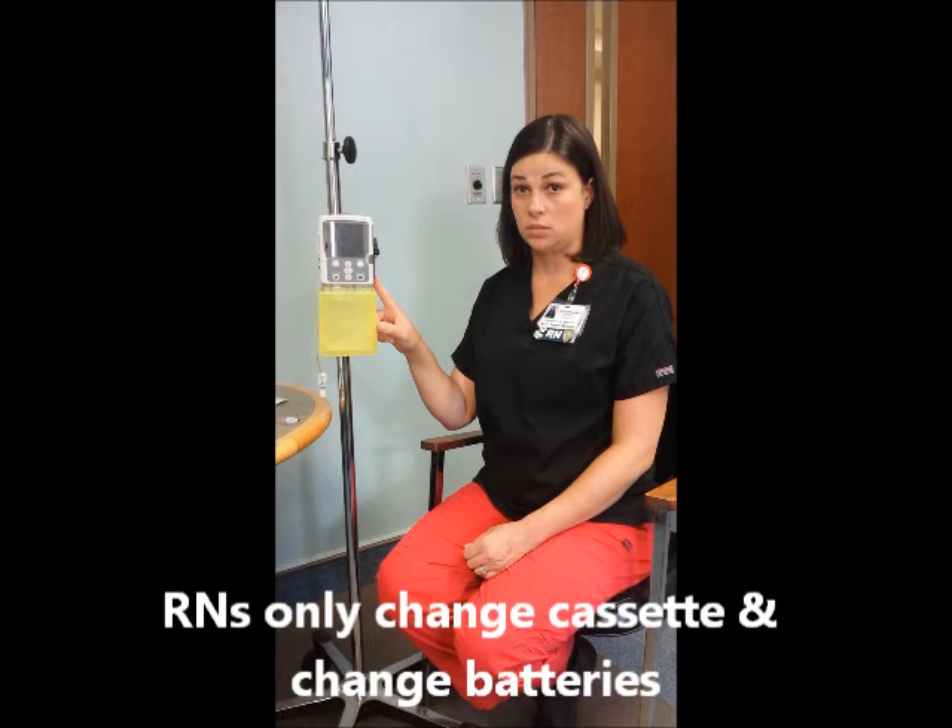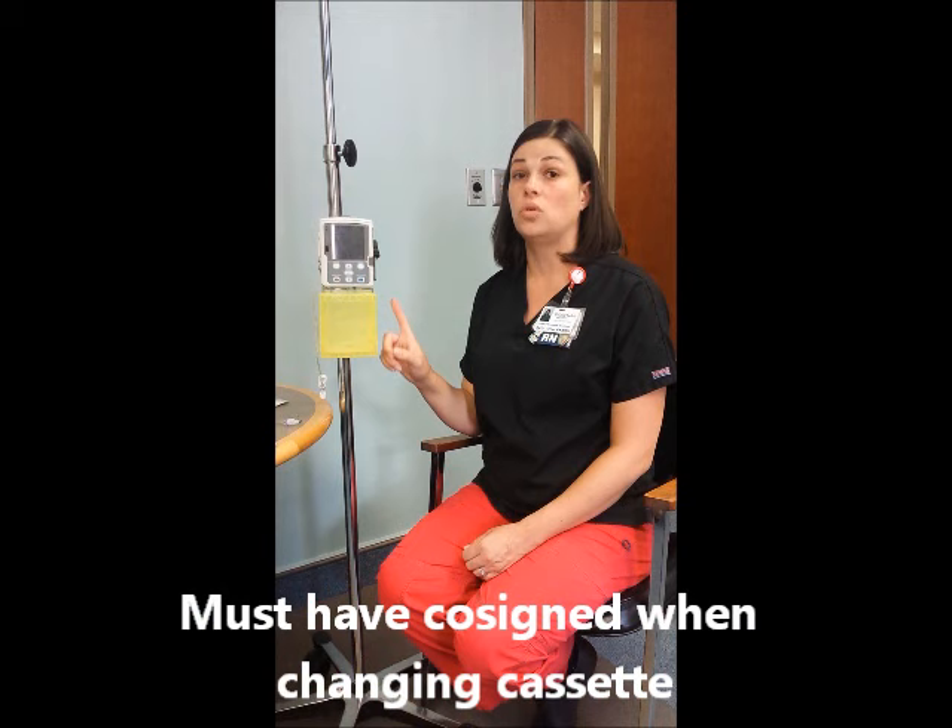The key points to remember for the CAD Solus pump: the RN is only responsible for changing the batteries and changing the cassette. These are controlled medications, so you will need a co-signer in EPIC at the time of cassette change.